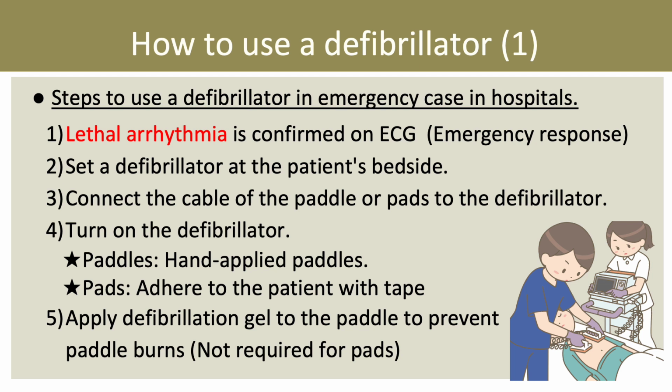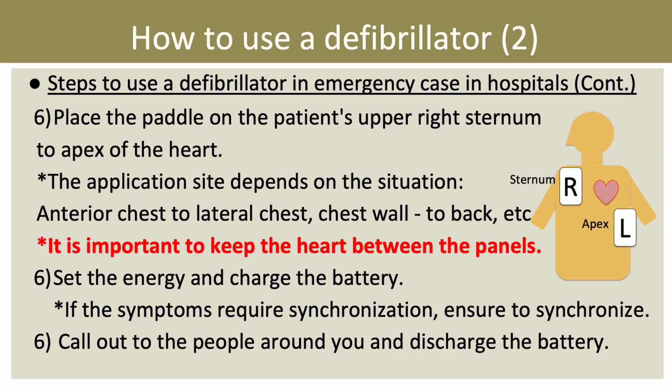Then, apply defibrillation gel to the paddle to prevent paddle burns. Please note that this is not necessary for the tape system. Next, press the paddle against the patient's upper right sternum and cardiac apex as shown in the figure. If there is no area to apply the paddle, find another area. It is important to keep the heart between the panels.